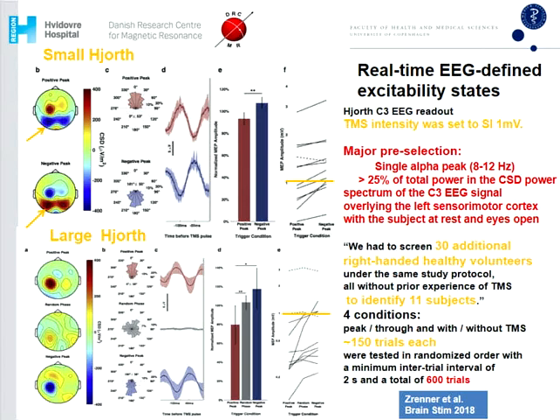One is a study recently published by Ulf Ziemann's group in Tübingen. They used exactly the same approach with slight modifications, and used a fast-sampling EEG system in order to focus on the alpha phase, up and down. What they found is a marked difference in the phase modulation, showing, as predicted by the literature, that in the trough you have a higher MEP size, shown here, and a lower one in the peak. With random stimulation, you are in the middle.